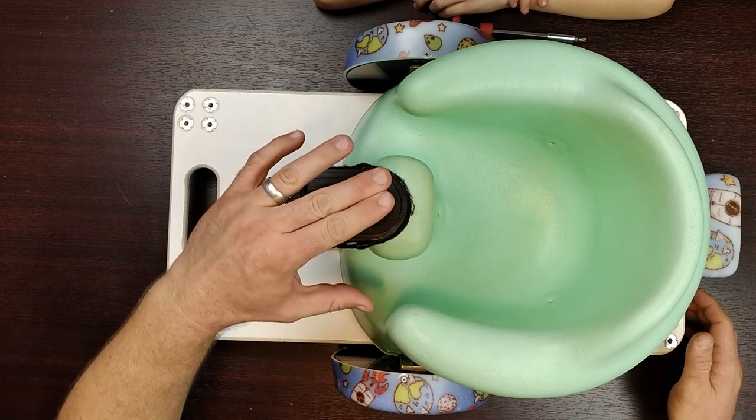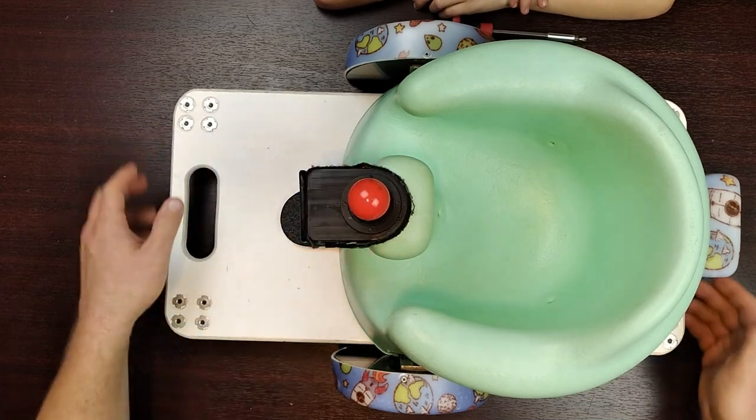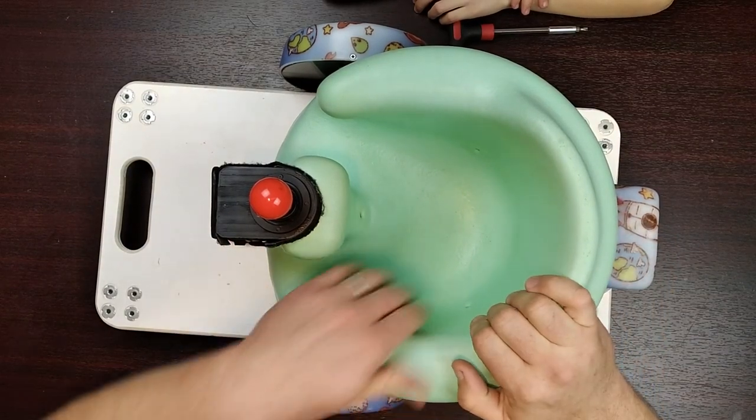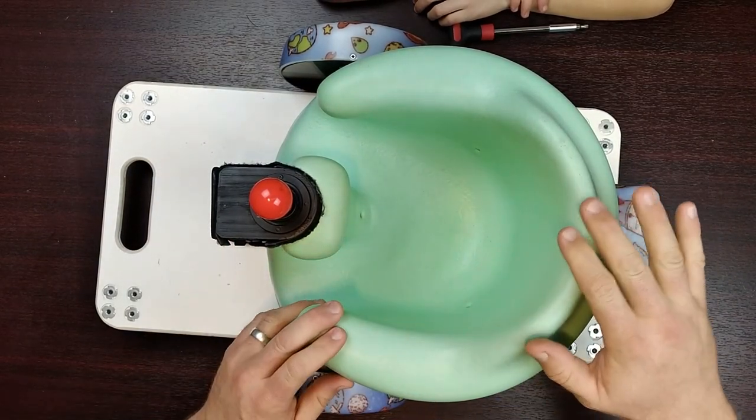There's a little power switch here and a joystick to be able to control it, and then it's using a nice little bumble seat. If you aren't familiar with the bumble, most parents are - they're magical things.